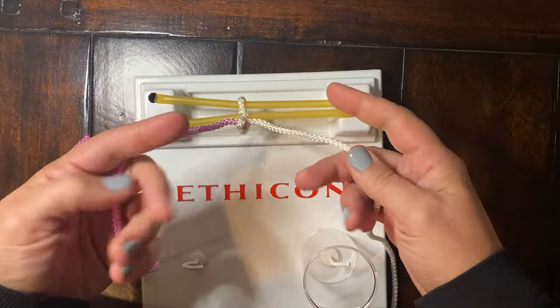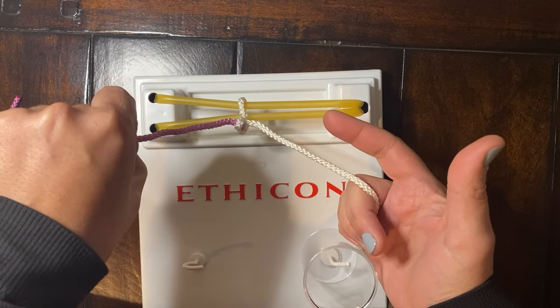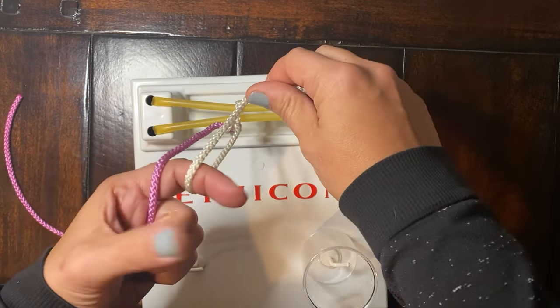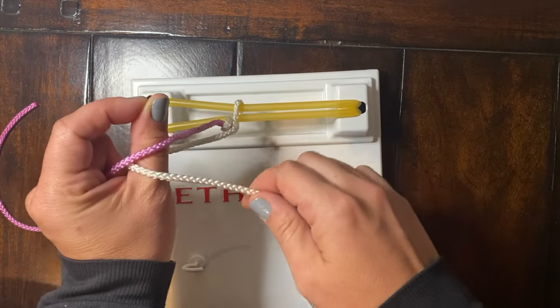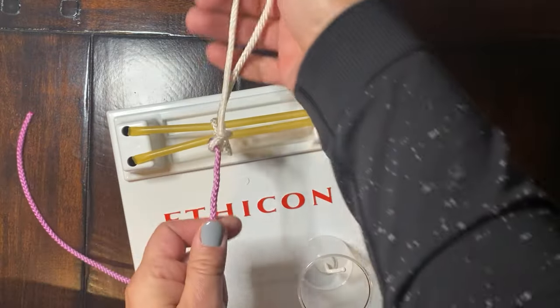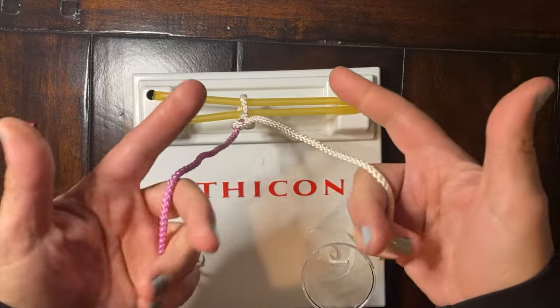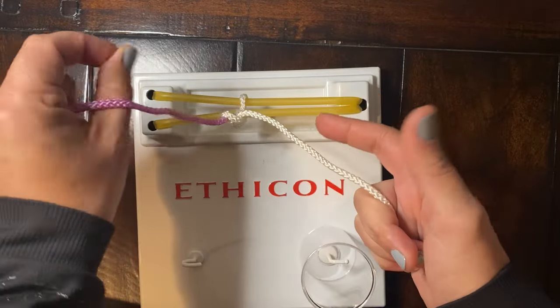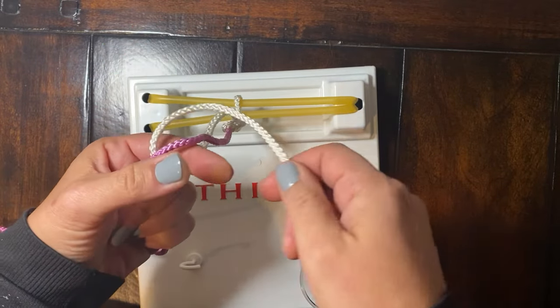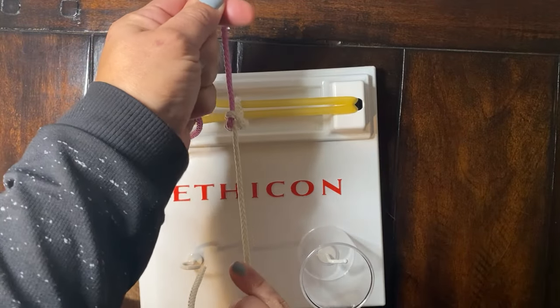To do that a little bit faster: start with the left hand over to make a ring towards you, open to cross, close the ring, rotate, open to pinch, rotate back, pull away. Second part of the series: ring, rotate away, open to wrap, close, rotate towards, open to pinch, rotate away, pull towards you.